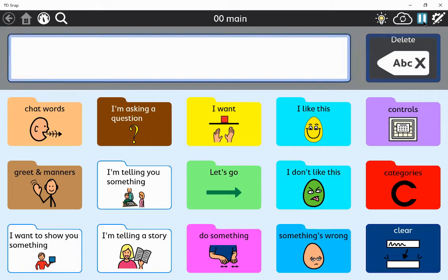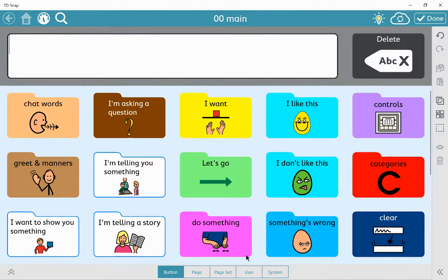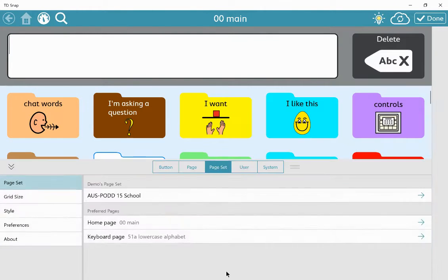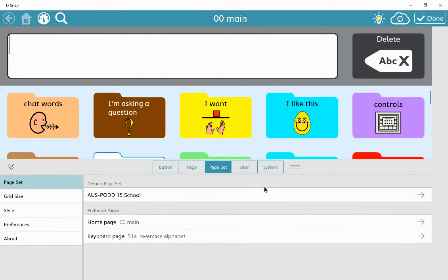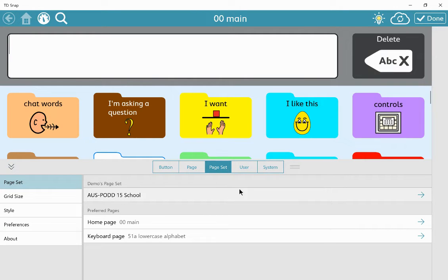If you want this to be a group scan, so it would say chat words, I'm asking a question, I want, etc., you'll need to do this manually.